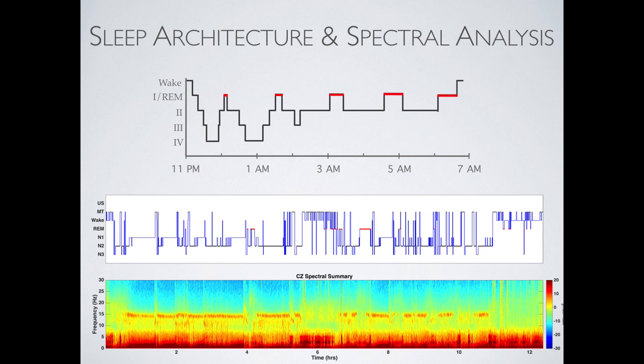This is when they're awake. This is when they're in light sleep and when their brain's working on memory processing. So you can get a sense over the course of an entire night, this is about 13 hours, about how the brain cycles between periods of wake and light sleep, where it processes memories in a particular way, deeper sleep and dreaming sleep, periods of wakefulness in between. And if you study it even closer, you'll be able to tell that the REM sleep, the dreaming sleep, and the awake looks utterly indistinguishable again, which is something that has been fascinating to memory and sleep researchers for quite some time.